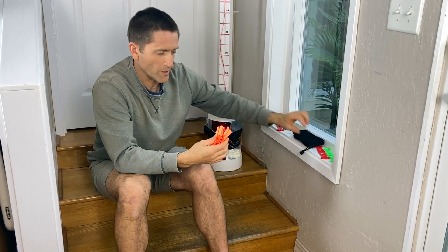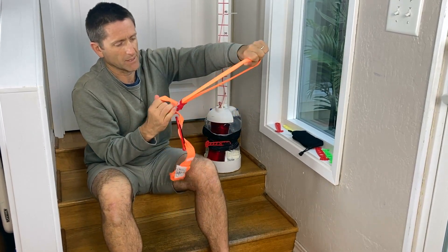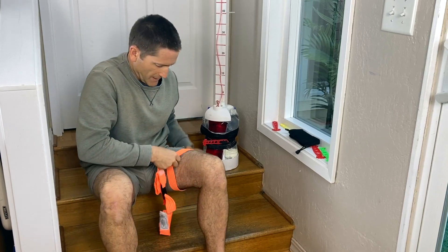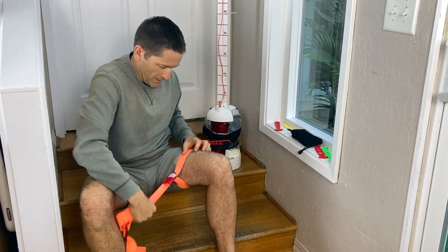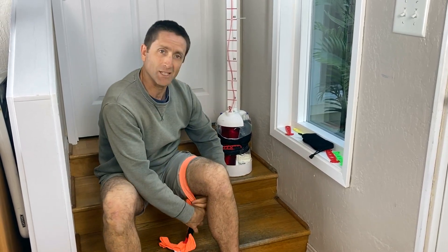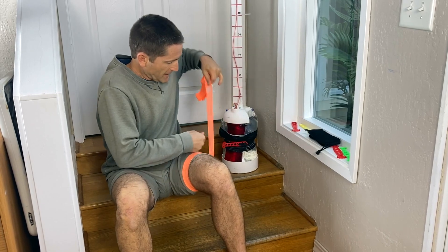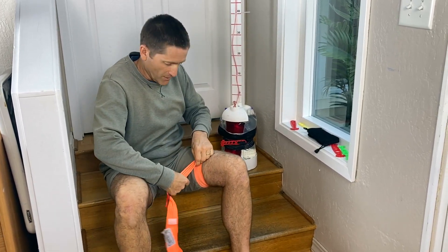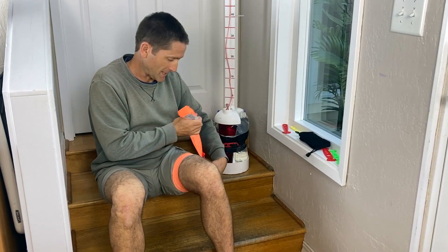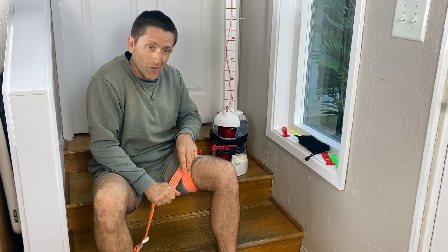What I'm going to do next is show how this gets applied to my leg. I take this loop, put it over my leg, and then I start to crank. Mind you, I don't need a windlass addition for my leg — my legs are about 60 centimeters circumference, and the wraps as they are do a great job stopping blood flow for my size legs. But if you have larger limbs, it gets harder and harder.